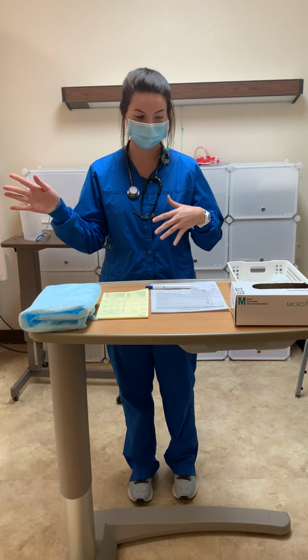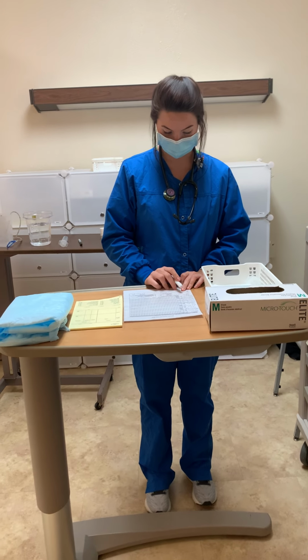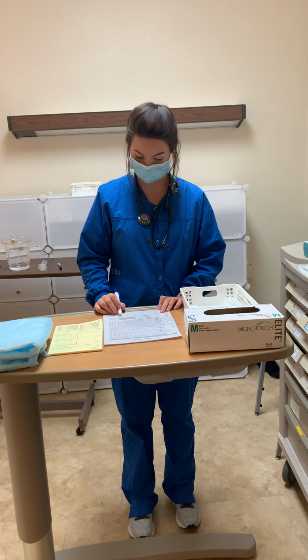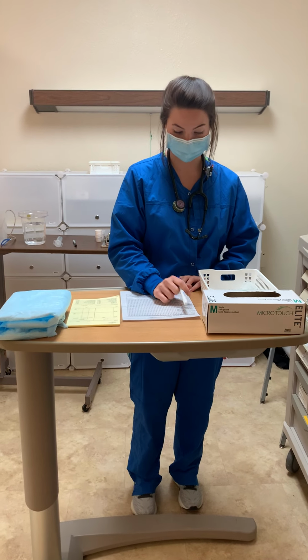So I'm going to do my hand hygiene, and I'm going to look at my MAR here. So my patient is Joanne Jones. She's allergic to penicillin. Her physician is Jeff Moberg. Her date of birth is 12/3/67. And the date today is 10/19, and we are doing her 8 a.m.